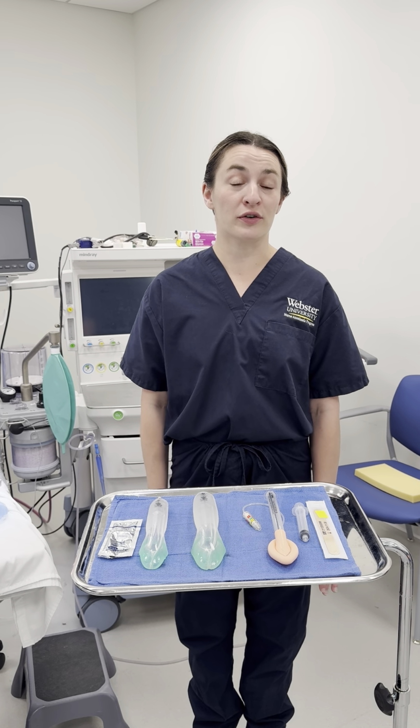So first things first, whenever you're going to use any sort of airway device, you're going to want to make sure you've got your basic safety skills and things set up. Make sure you've got suction in the room that it's functioning, working and on at all times. You're going to want some lube to lubricate the back of the device. Depending on what kind of device you have, whether it's a first generation LMA that has a cuff or a second generation iGel that doesn't have a cuff, you're going to make sure you've got a 10 cc syringe so that you can inflate the cuff if you have it, okay? And you'll be able to tell. And the last thing you're going to want to have with you is a tongue blade or a tongue depressor, just to get the tongue out of the way for insertion.